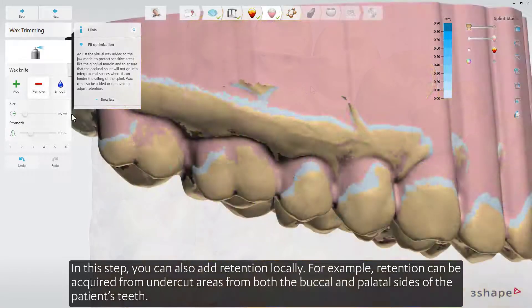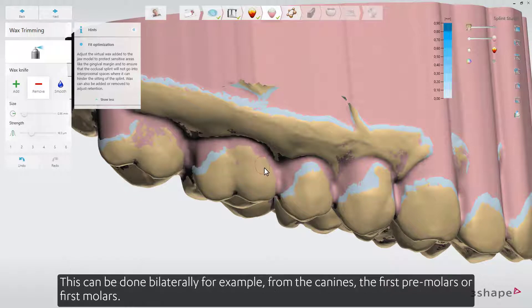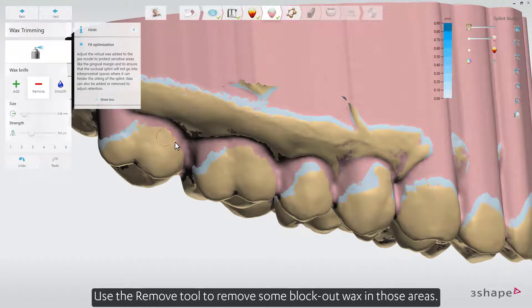In this step, you can also add retention locally. For example, retention can be acquired from undercut areas from both the buccal and palatal sides of the patient's teeth. This can be done bilaterally, for example from the canines, the first premolars, or first molars. Use the Remove tool to remove some block out wax in those areas.